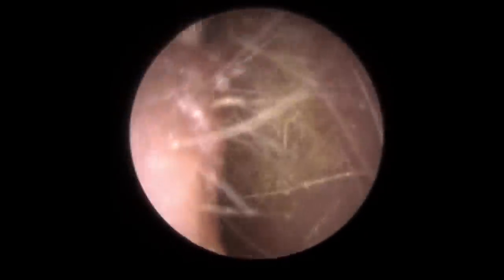I've just backed away a little bit to get the angle with the suction tube. Just trying to get a grip and pulling from the side — now we're getting some movement. You can see it starting to come away from the corner of the drum and the corner of the canal. Aiming for that flatter section, holding on to it, gently teasing this out. There — it's come away from that bottom section. We're slowly breaking away all the adhesions around the side. Now let's get that top section down and away — got a good grip, it's moving — there it comes. That whole top section just came away.